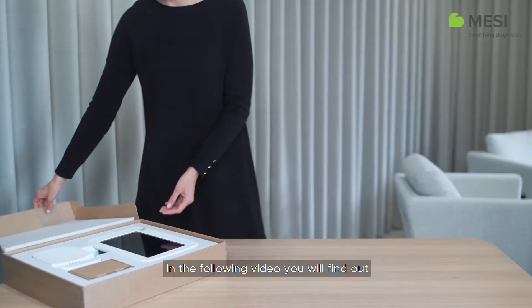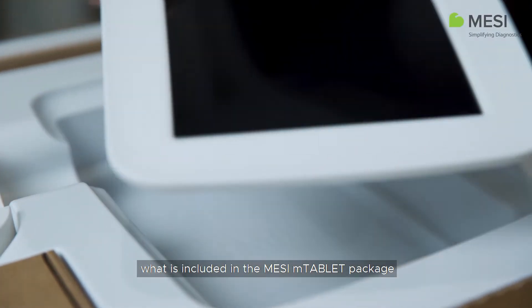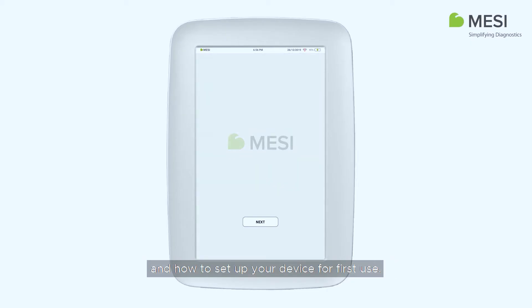In the following video, you will find out what is included in the MESI mTABLET package and how to set up your device for first use.